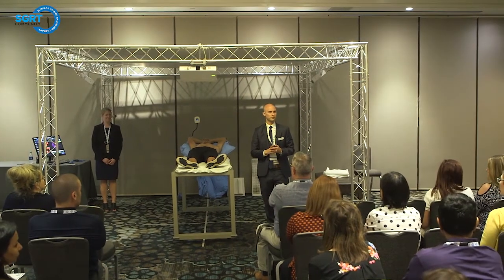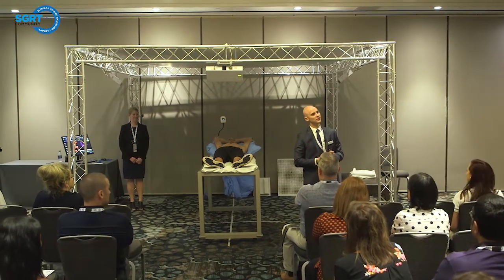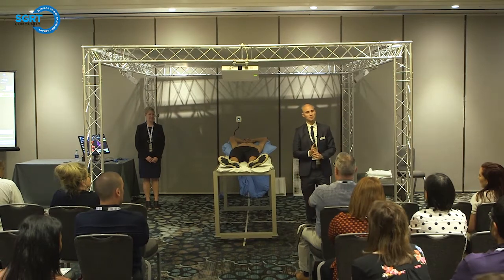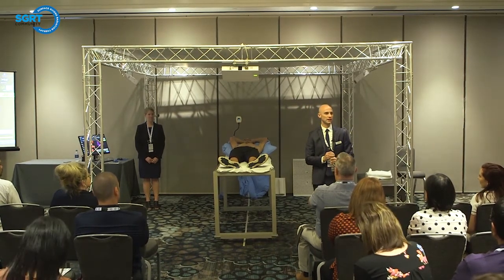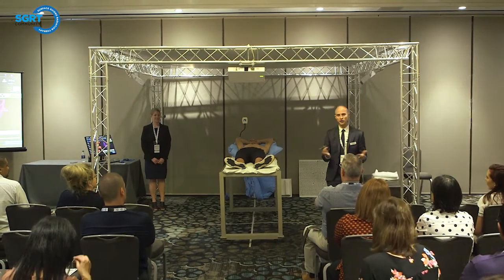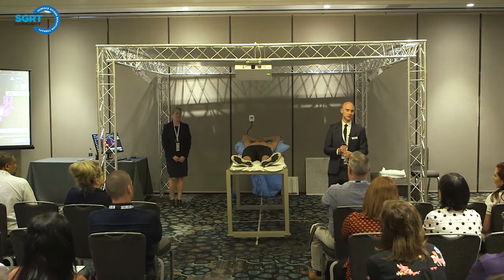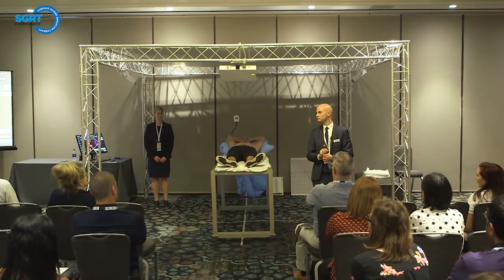Makes the patient more nervous by focusing on them. I haven't seen that, but that's going to be, I think, based on each patient. I think each patient's going to be different, and their needs are going to be met in a different way. Yeah. So as the therapist, I think we kind of know how to explain certain situations to certain patients. So it's a good question.